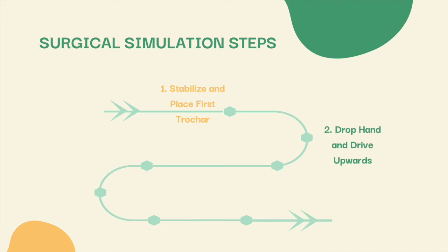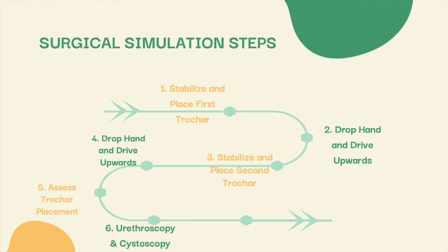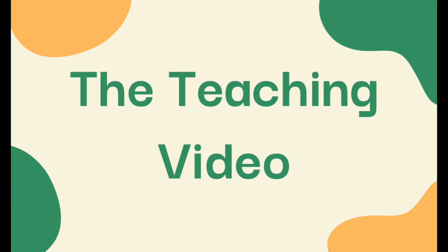We start by demonstrating how to handle the trocar and insert the sheath, followed by proper placement and motions for placement of the sheaths. Confirmation of appropriate placement and tensioning will also be discussed. Tips will be given along the way from an expert surgeon.